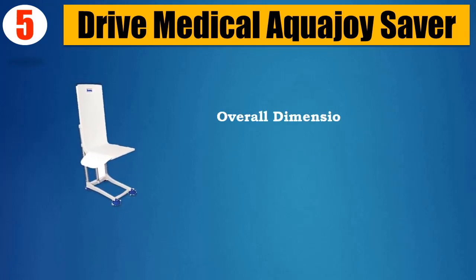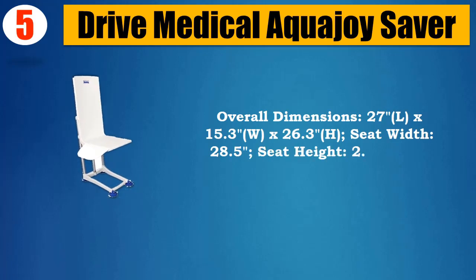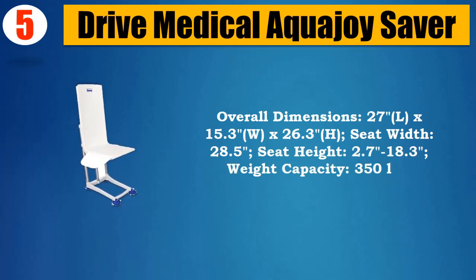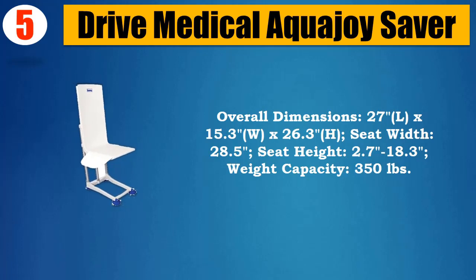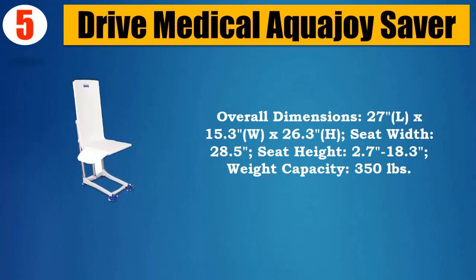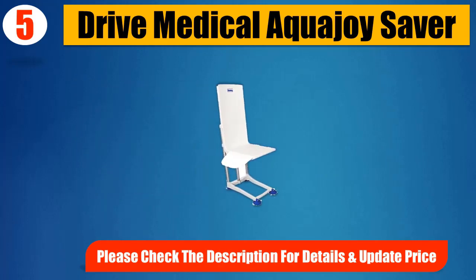Overall dimensions: 27L x 15.3W x 26.3H. Seat Width: 28.5. Seat Height: 2.7–18.3. Weight Capacity: 350 lbs. Please check the description for details and updated price.